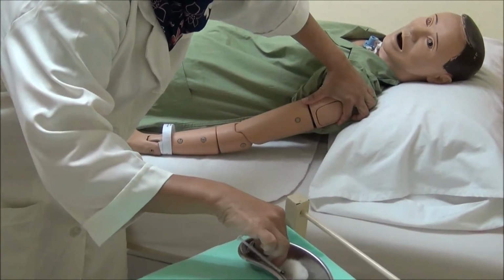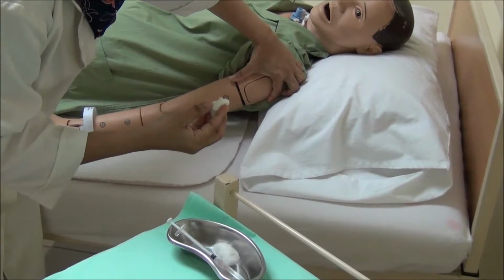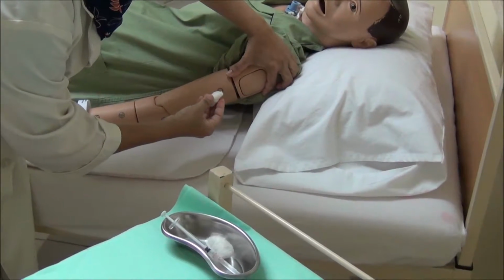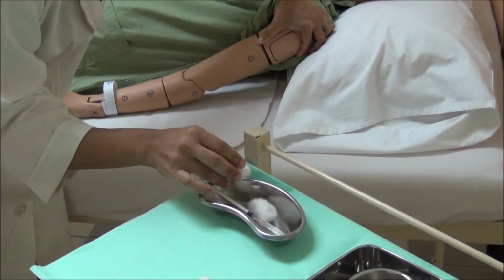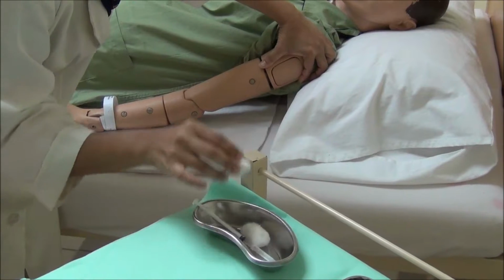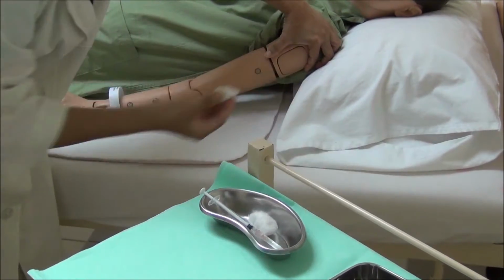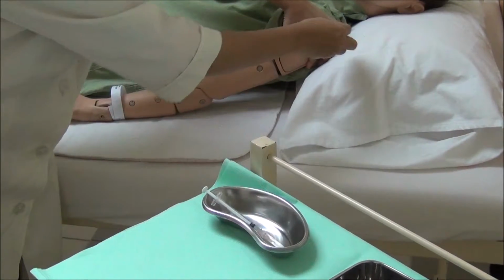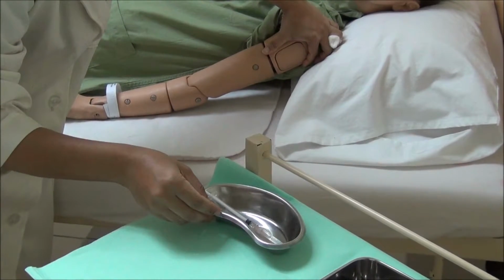To locate the deltoid, place your first finger at the acromion process and 3 fingers below the acromion process. The triangle above the axillary line and below the 3 fingers is the area where you need to inject. Cleanse the site with alcohol swab using circular motion, moving outward about 5 centimeters. This is to reduce the number of microorganisms and also allow alcohol to dry. This is to prevent skin irritation from alcohol.